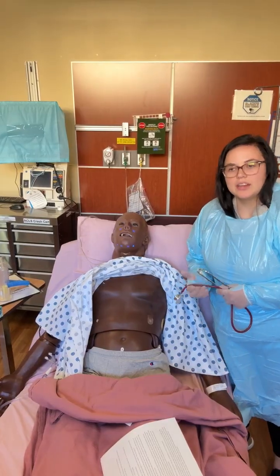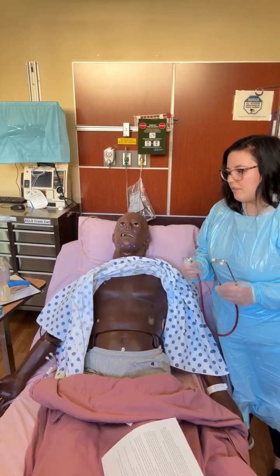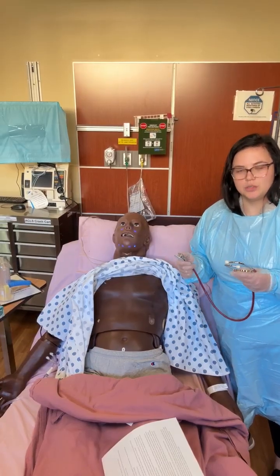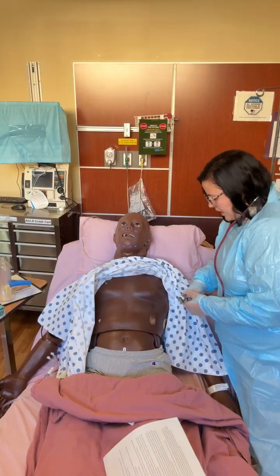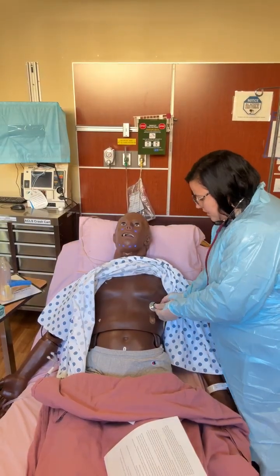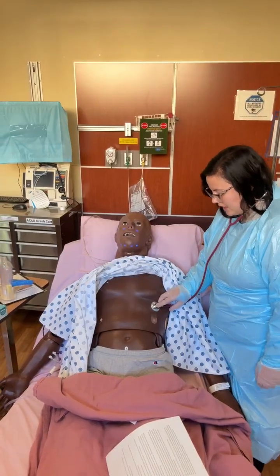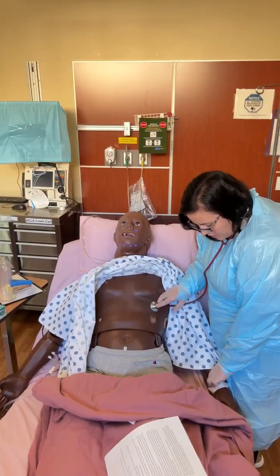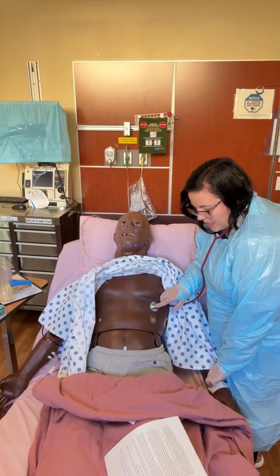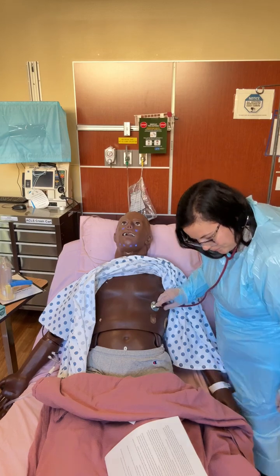We do realize that normally there would be an isolation stethoscope in the patient's room, but for sim purposes, we're going to allow you to use your own stethoscope. So you'll take your stethoscope, and you'll put it here, and this is where you will count for your heart rate. If you have trouble hearing that, it's not cheating to also palpate for that radial pulse and listen at the same time to make sure that what you're hearing and feeling match.